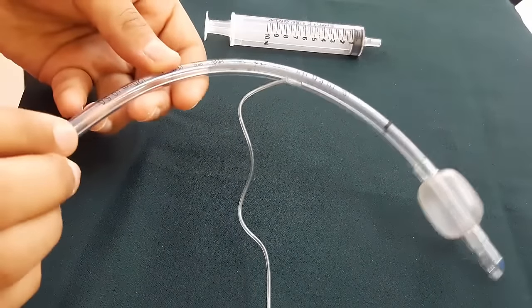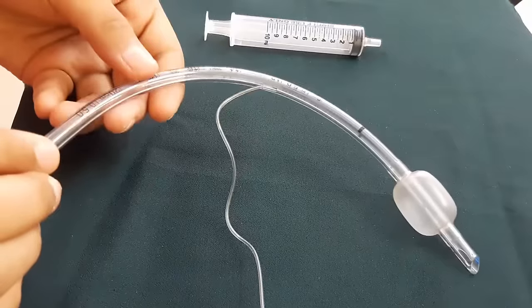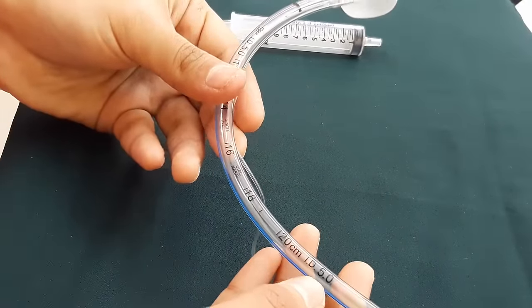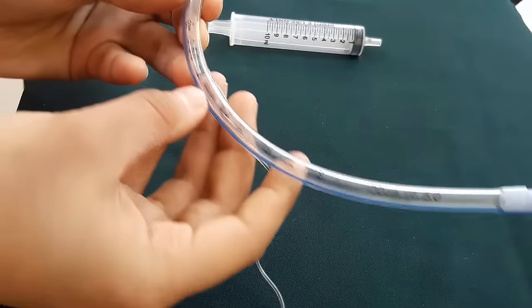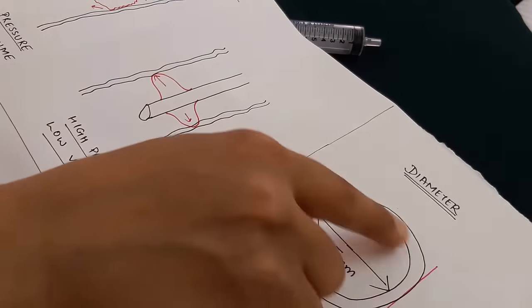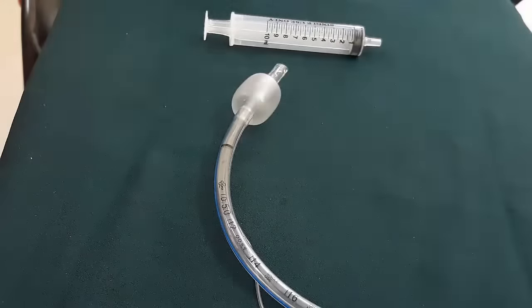Talking about the size of the ET tube — the size refers to its internal diameter. So if you ask for a size 5, you are asking for an internal diameter of 5 mm. As you can see, it is written: internal diameter 5 mm and outer diameter 6.9 mm. The markings clearly distinguish the internal from the outer diameter.